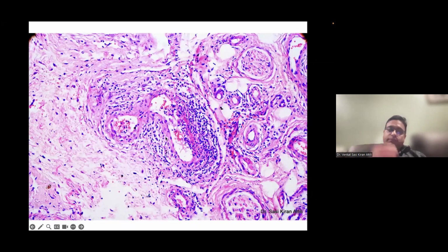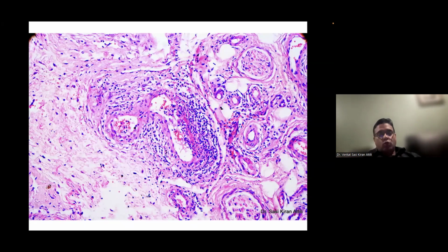So this case made me convinced that Ackerman was probably right in calling livedo vasculopathy not only a vasculopathy, but also an itis. But maybe there's an overlap. In some cases, you've got pure vasculopathy only. In some cases, you've got an itis as well. And there may be cases of, say, antiphospholipid syndrome, where it's purely a coagulation disorder.